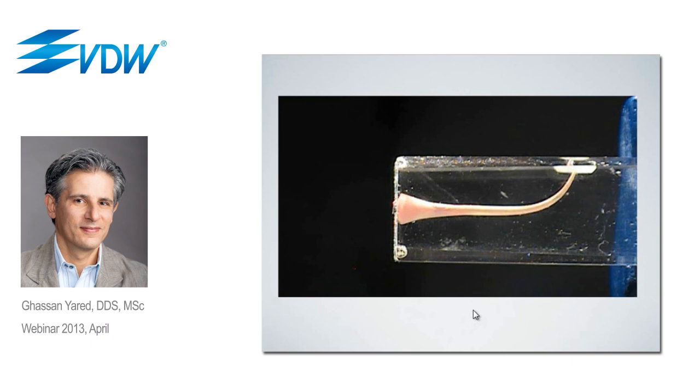Now I'm going to show you a video clip showing the removal of a Thermafil carrier. This video clip was edited, so you will not see the use of chloroform here, but this is a canal where I used chloroform to dissolve the gutta-percha.